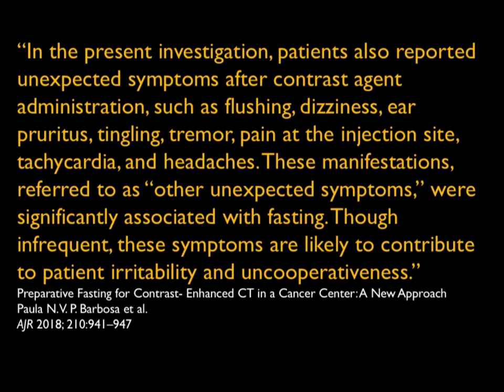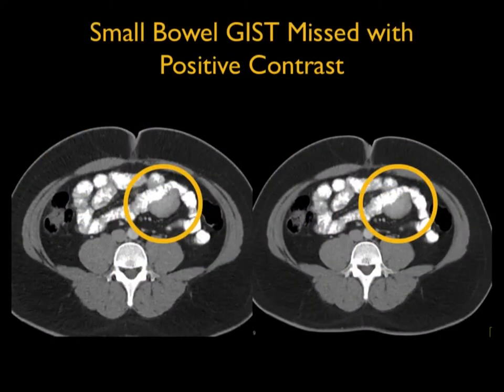People ask the question, well, what if the patient ate a cheeseburger? Would you still do the study? The answer is yes. Now, in terms of detection, the reason we always give contrast, whether it's neutral or positive, is we want to pick up lesions.